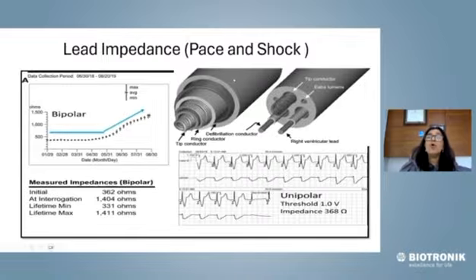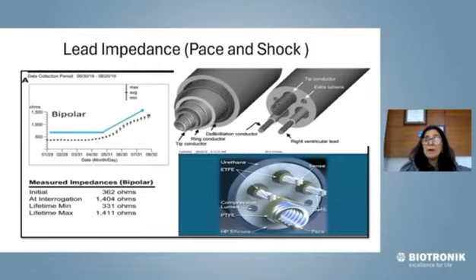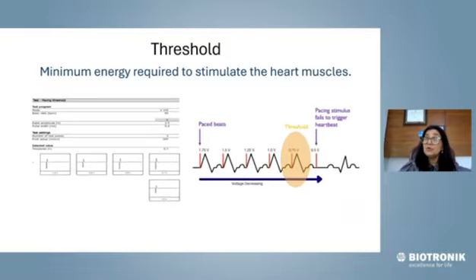So the inner one remains all right, but you don't program unipolar in defibrillators. Remember, ICD leads are complex, and hence we've shown you these pictures that there's so much happening, multifilar going within the lumen. The threshold, you are well aware. I told you every time the patient comes for a follow-up, you need to check the threshold. The minimum energy required to stimulate the heart myocardium is what is the threshold.